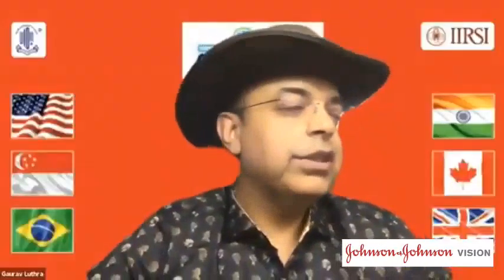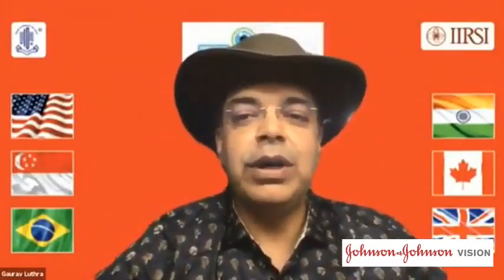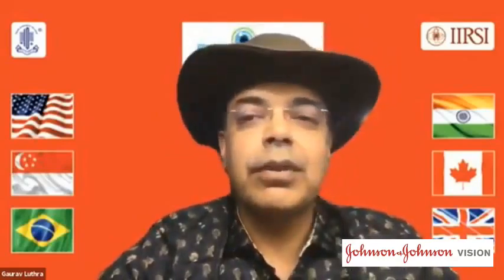So there is another question for Dr. Eric. What kind of forceps do you use for the glued IOL, and what kind of IOL do you use for the glued IOL? These were 2 questions put up by Devdutt. Yeah, so for the glued IOL, I like the CT Lucia, the Zeiss lens with the most flexible haptics of any haptics we have. So that's my IOL of choice.